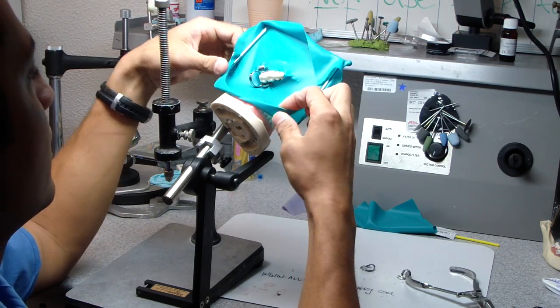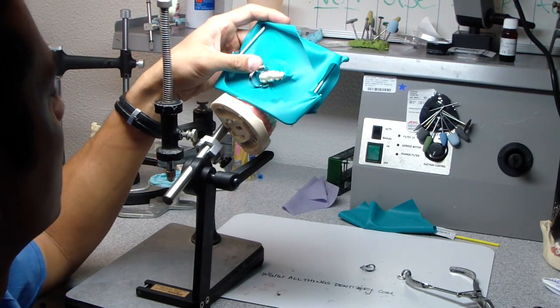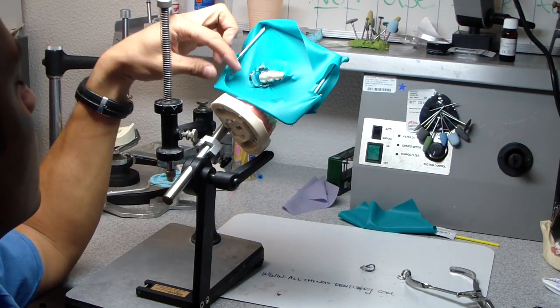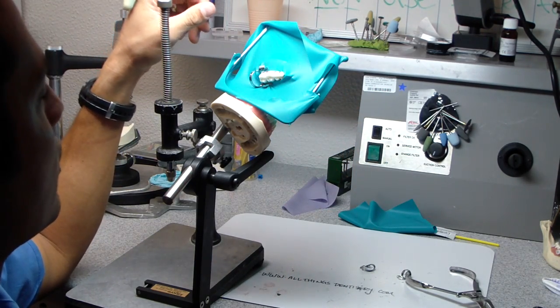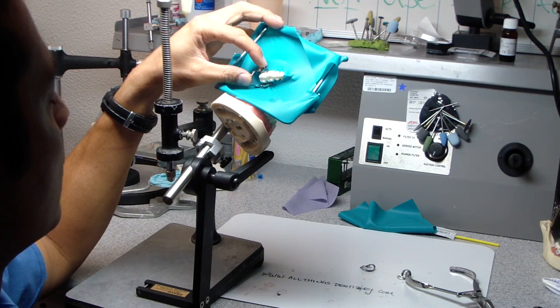Crazy, never taught me that in dental school or anywhere. I don't even think dentists know that little trick. So that keeps, you're always getting fluid running down. So that's one trick about placing rubber dam.